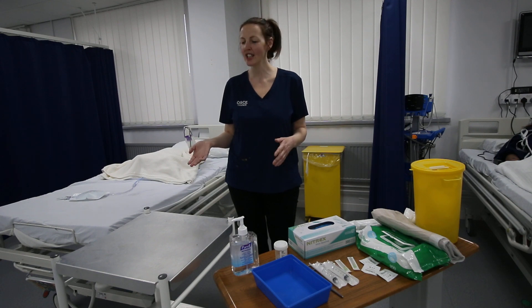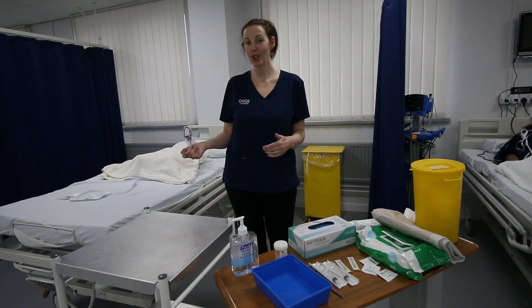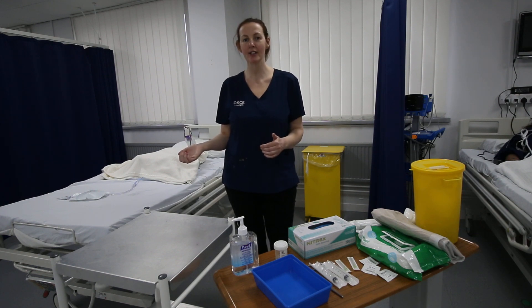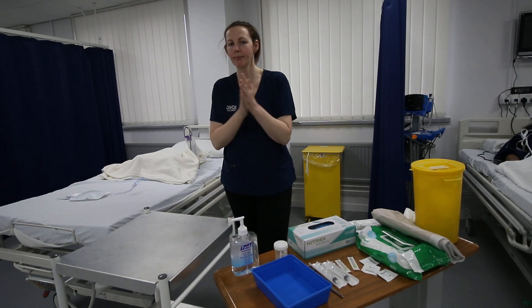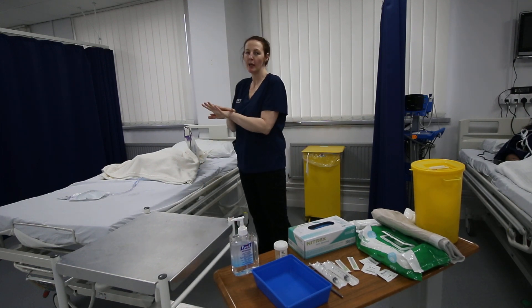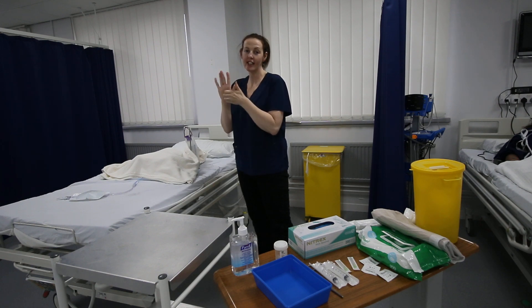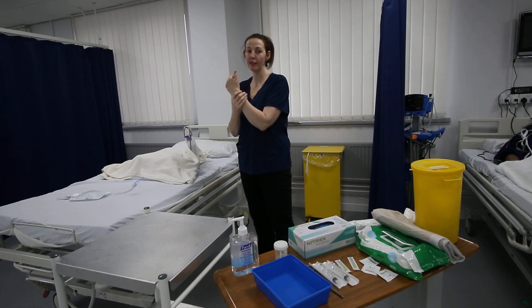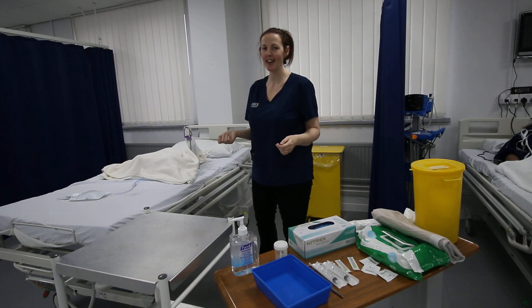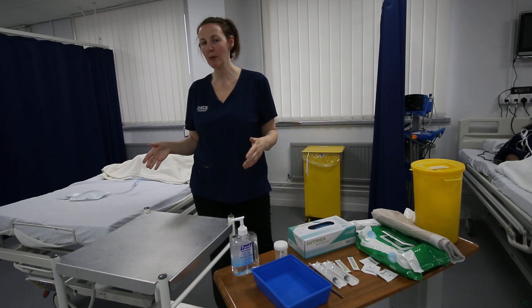I'm going to go into the station now and we'll do it as if I was you — I'm a nurse doing my NMC OSCE. I'm going to gel my hands and confirm with the OSCE examiner that my patient's three-way ID check has been completed, allergy status confirmed, and I've obtained informed consent for the procedure. Is that right, examiner? Yes, okay.